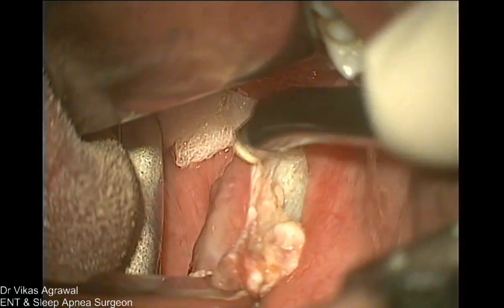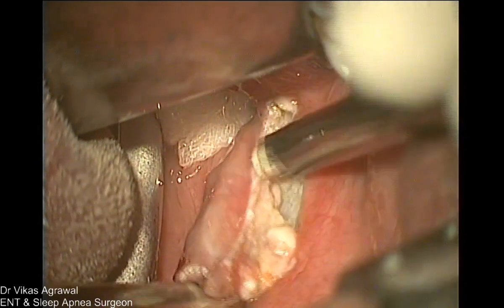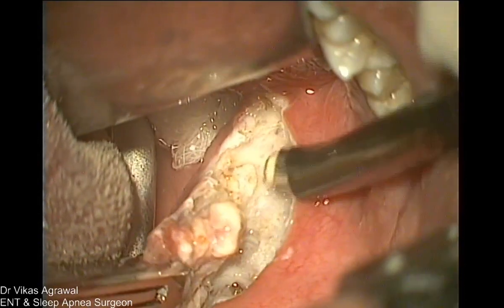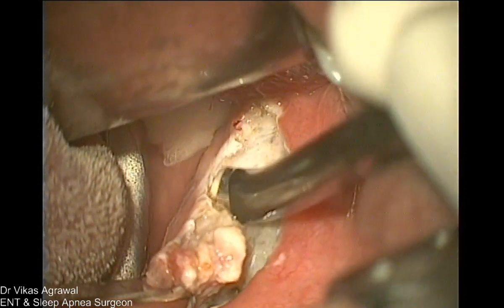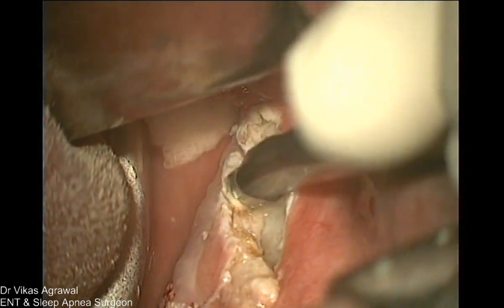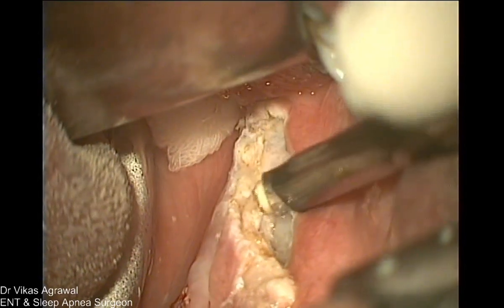So now we know that this side we do not have to expose the tonsillar artery. So what I am doing is I am leaving the lower pole of the tonsil and going intracapsular here. So now this is the tonsillar tissue. I am going inside the tonsillar tissue, making sure that I don't hit the tonsillar artery. Obviously at this point of time there should not be any unnecessary movement, because your control will get lost otherwise.